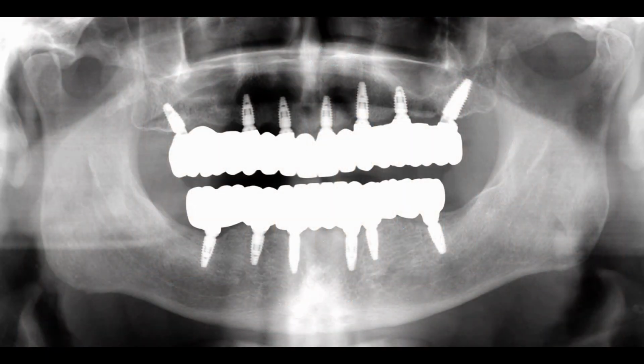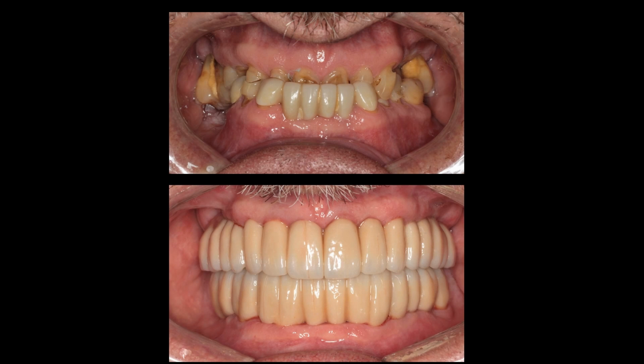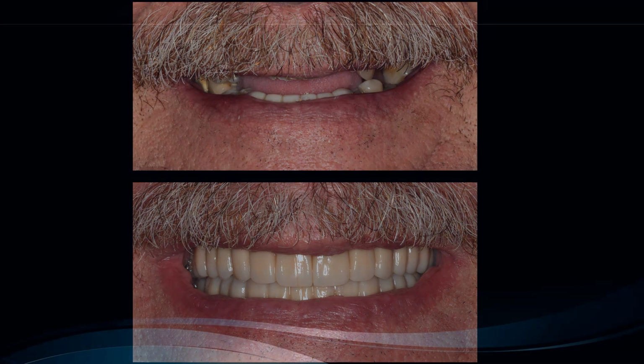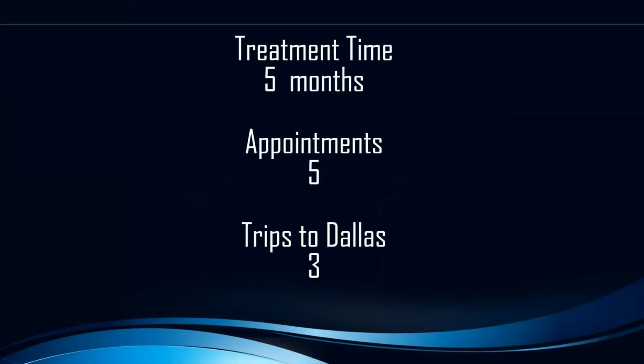This is the final panoramic radiograph. Here's his before and after lips retracted. Here is his before and after smiles. His treatment took us 5 months. He had 5 appointments. We piggybacked some of those so that he only had to make 3 trips to Dallas.